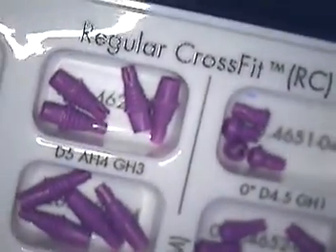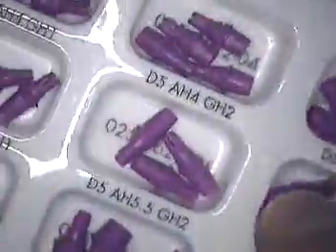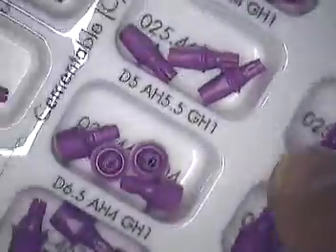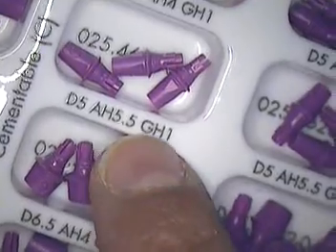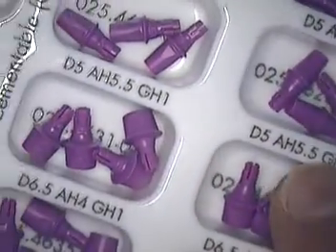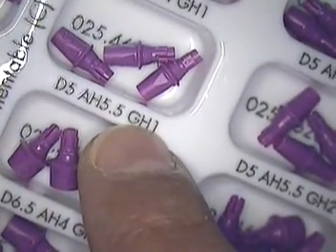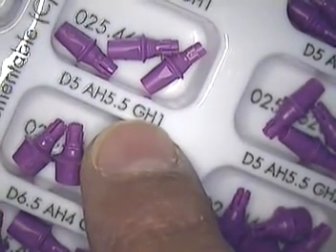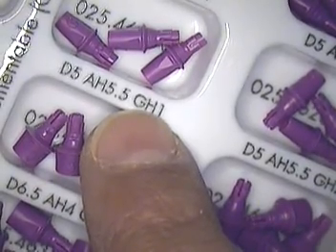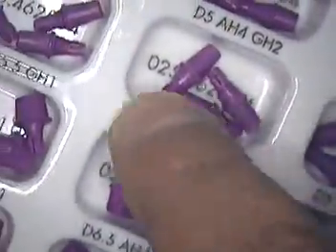Let me show you the kit where you can obtain these regular crossfits. These are the associated numbers. I happen to select out of the kit a D5 AH 5.5 GH1 and its associated GH2. The gingival height is telling you that they're giving us about a millimeter gingival height from the end of the abutment, so one's a little bit longer than the other.